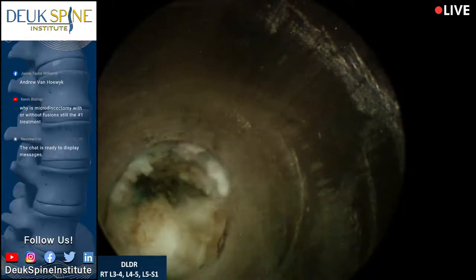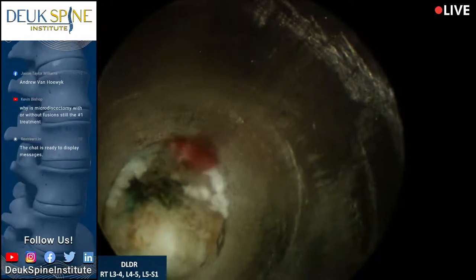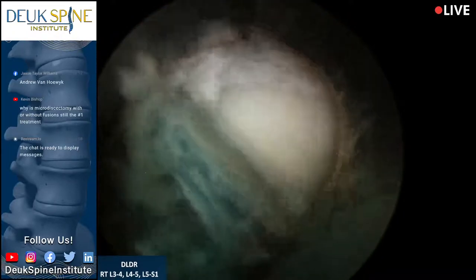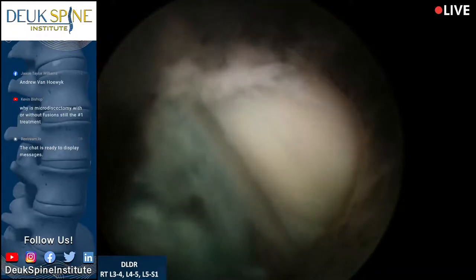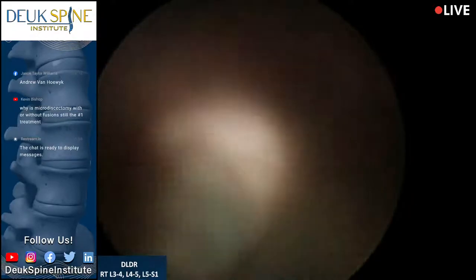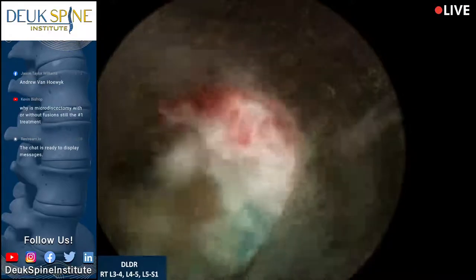Beautiful. That's it. Laser off. There's the nerve right there. We don't get to see it often. You all see that? Since I am at the L4-5 disc, that's the L4 nerve root right there. But you see how close it is to where the herniation was.